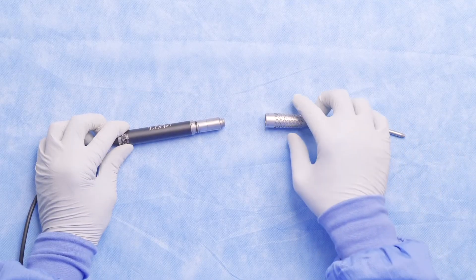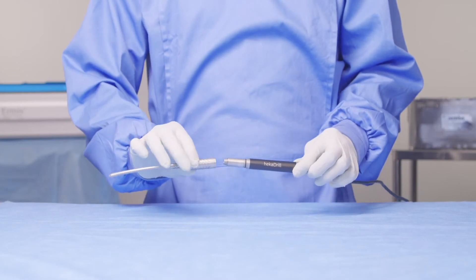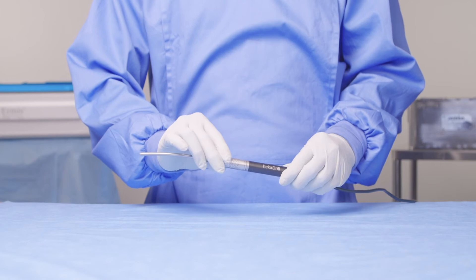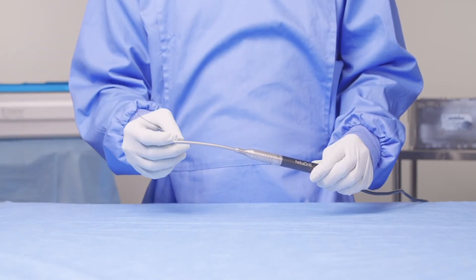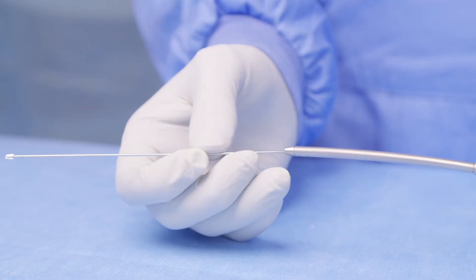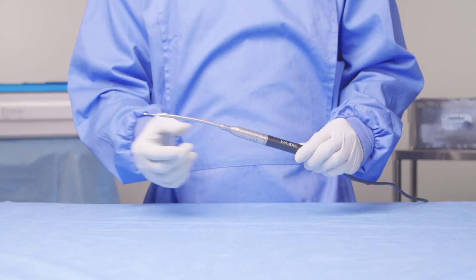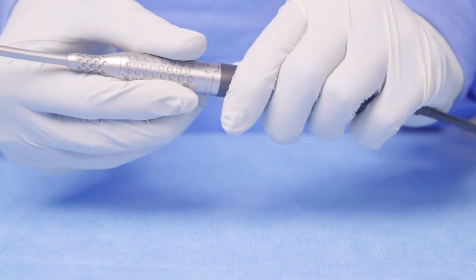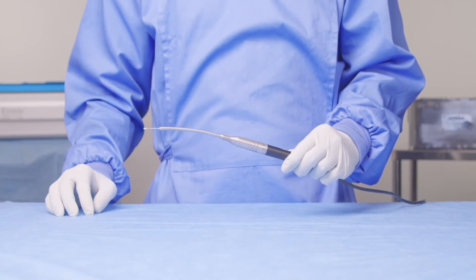Now let's take a look at our curved minimally invasive burr attachment. Firstly, take the attachment and slide it over the end of the handpiece to the unlock position. At this stage, you can take your flexible burr — please ensure you have the right range — slide it into the end of the attachment, and then click the attachment from the unlock to the lock position. Once in the lock position, the handpiece is ready for use.